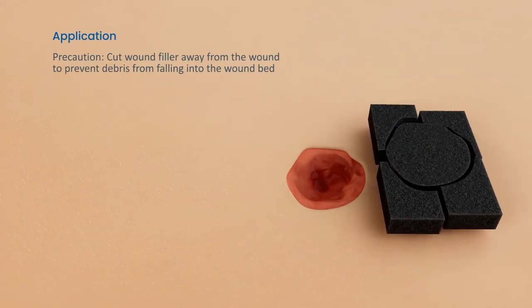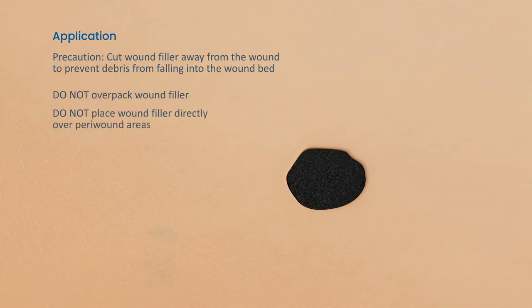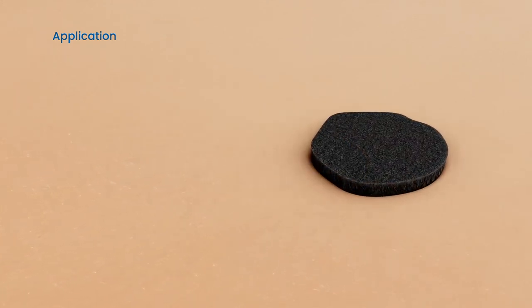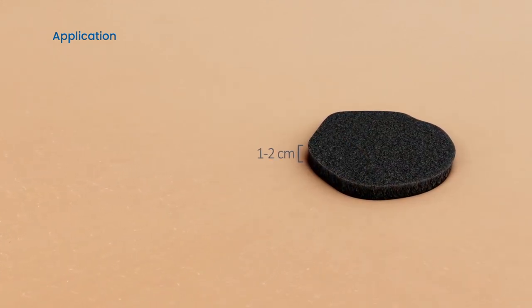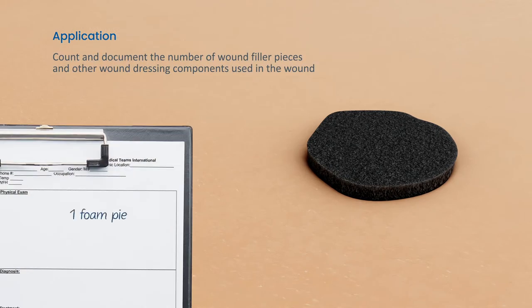Cut the wound filler to the shape of the wound and place inside, packing the entire wound bed. Do not overpack. Do not let the wound filler overlap directly onto intact peri-wound areas. Ensure wound filler extends 1-2 cm above the surface of the wound bed. Count and document the number of wound filler pieces and other wound dressing components used in the wound.